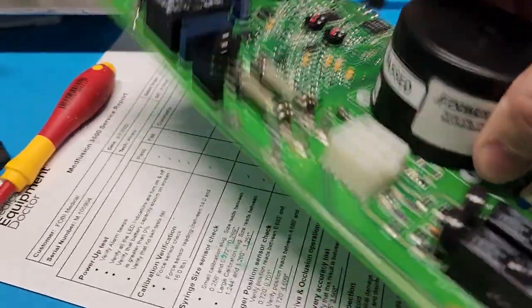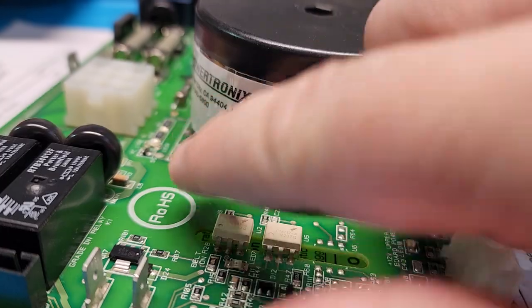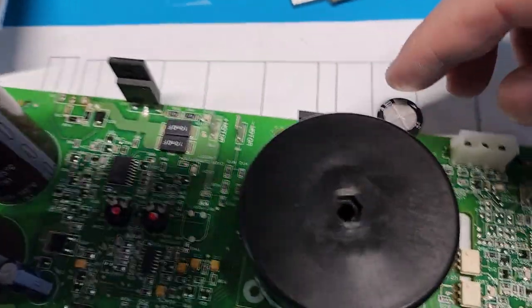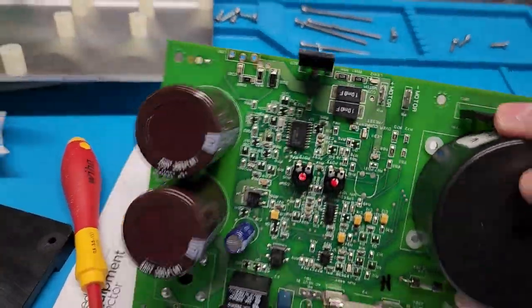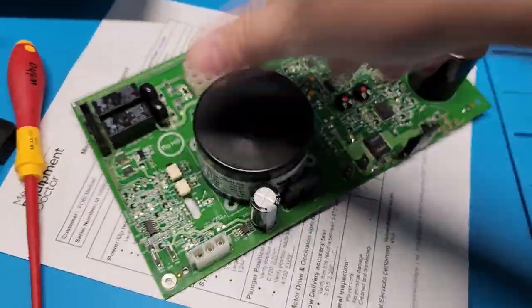All right, so let's look at the intricacies of this board. You can see right here, it's got multiple power taps. It is a 220 volt power board, and you can see it's got multiple bridge rectifiers. So I've got bridge one, another one over here, bridge two, and let's see, where was the other one? Well, you have to trust me, there's three of them on there. I don't know why I can't find the third one right now.